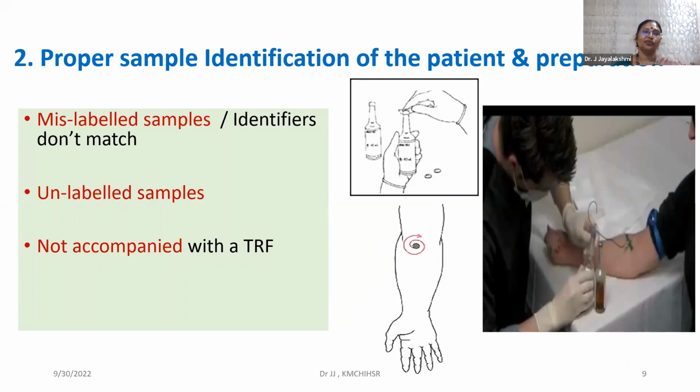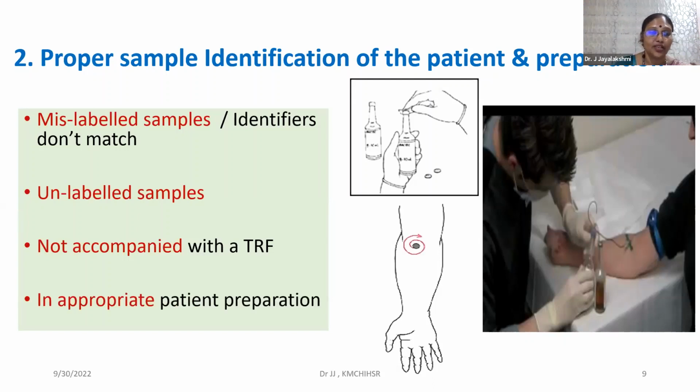So this is something that you need to be very careful about. Even if your samples are not accompanied by a test request form, and you are going to accept them and await the form, you should have an interim area to hold back such samples which are in query, so it is important that you store them appropriately. This is another thing that would be a problem for us in the pre-analytical or pre-examination phase.